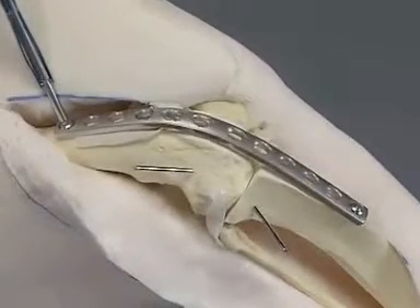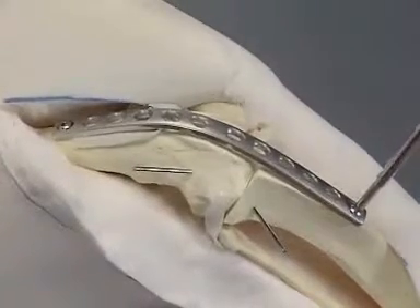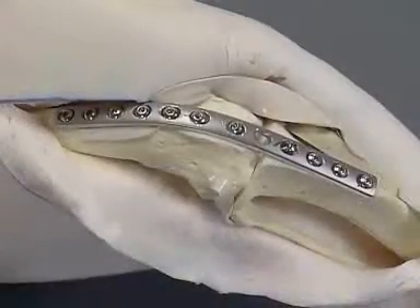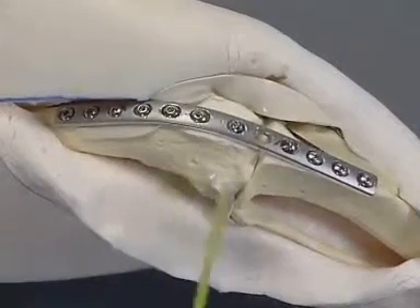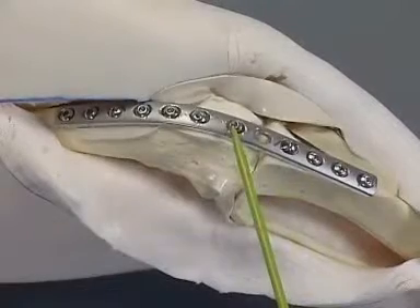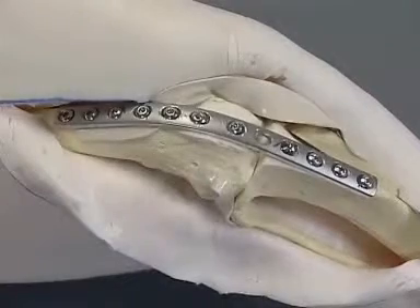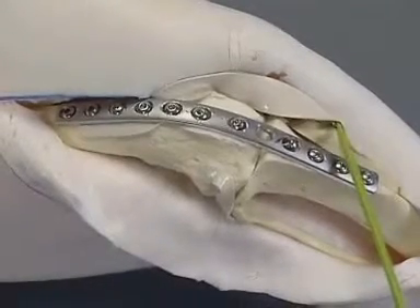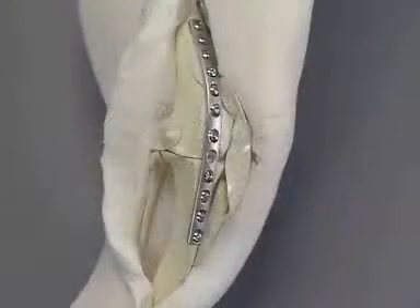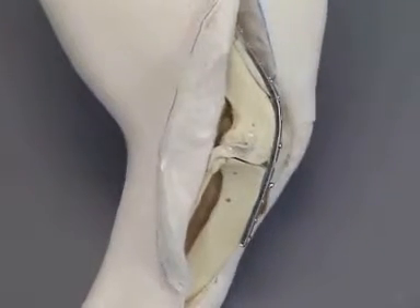The plate is secured by first placing screws through the most proximal and the most distal plate holes. The remaining plate holes are filled and the K-wire is removed. If possible, one or two screws are placed as lag screws across the joint to increase interfragmentary compression. The tibial crest is attached to the medial surface of the tibia with a lag screw. The axial alignment of the limb and the angle of the arthrodesis are critically observed.